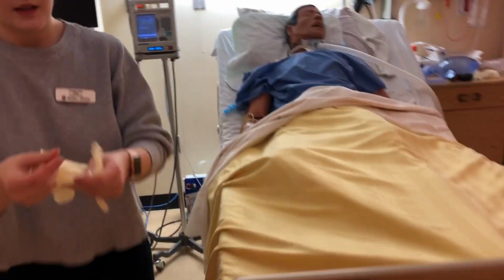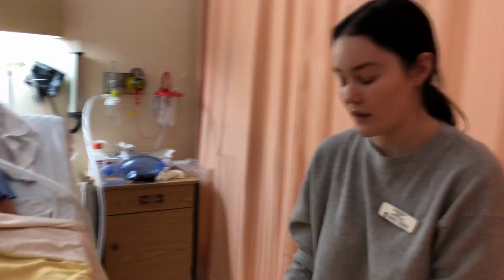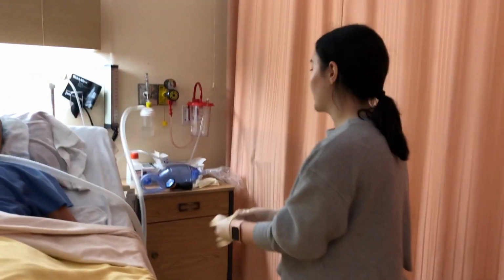Okay. So everything is unclamped. Do you want to wave them down? Yeah. Oh, it stopped. It stopped. Okay.